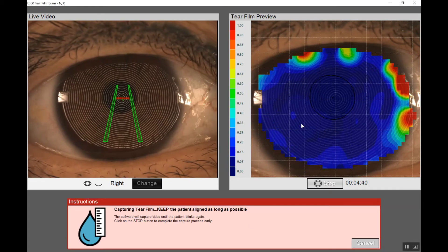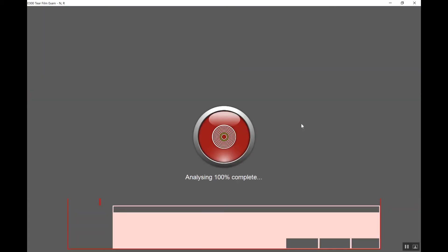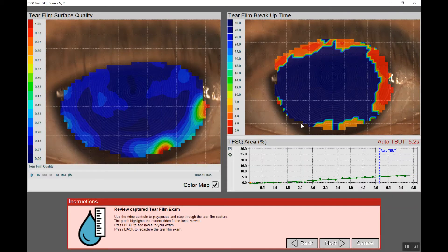We ask our patient to hold their eye open as long as they can, up to 15 seconds, or until they need to blink. The test completes when either a third blink occurs or 15 seconds is reached. In this case, our patient was able to stay open for about six seconds, registering a tear film breakup time of 5.2 seconds.